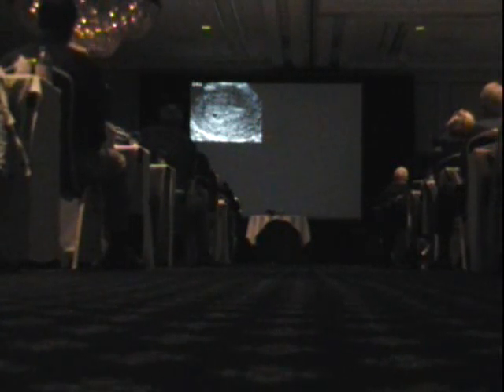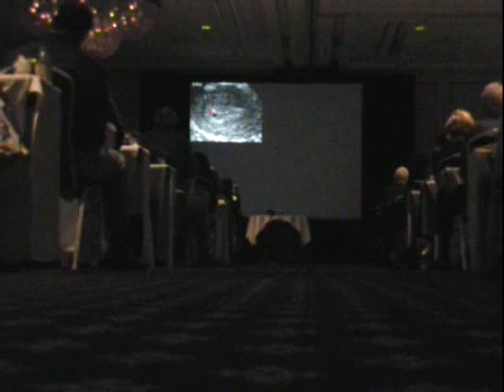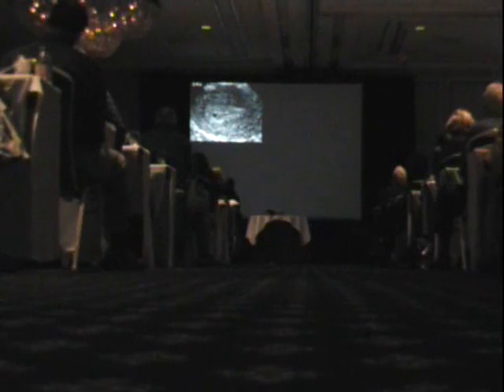Here's a transvaginal scan. There is a little gestational sac in the uterus. You can see it's a gestational sac as opposed to some fluid in the endometrial cavity. First of all, because it is beside the cavity, this line is the potential space of the endometrial cavity. So it's beside it instead of within it. Also because there's an inner ring and then a brighter outer ring around it. The double decidual sac sign indicates that this is a gestational sac.